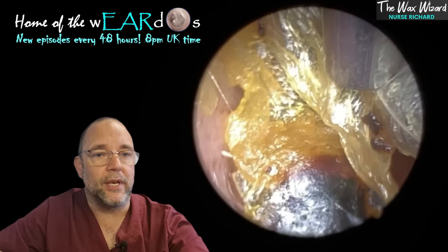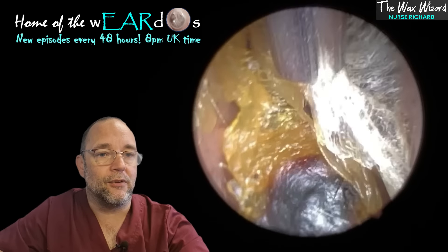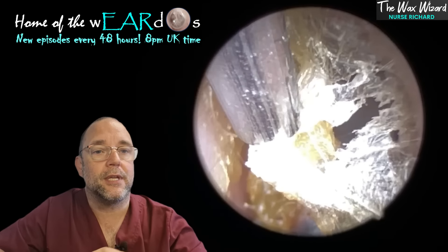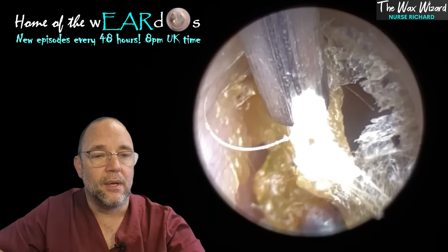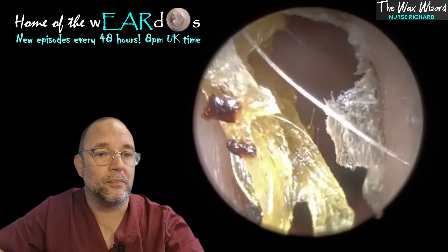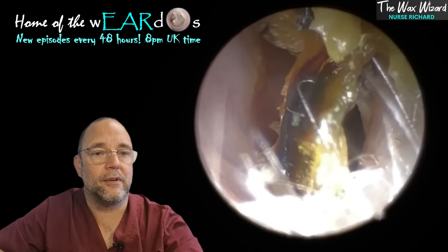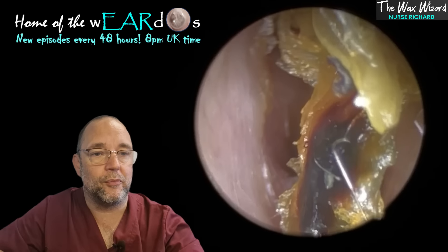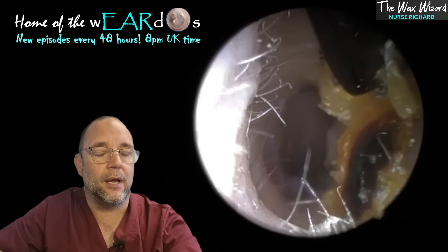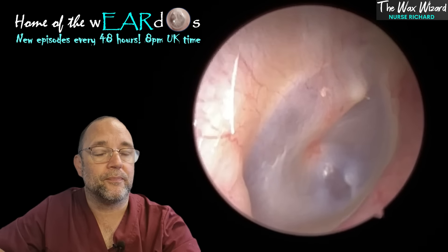The next one — this lady has quite a story. She had some bleeding in this ear, and I'm not sure if that might explain that little dark area there — it could just be very oxidized skin. She'd had surgery; I think it was a couple of years ago. She had a grommet put in. She actually believes it wasn't inserted properly, because it fell out quite quickly afterwards. A grommet is a little tube inserted through a cut hole in the eardrum to help equalize middle ear pressure. There's certainly no evidence of any grommets now, and this bit could be what migrated off the eardrum — it might have taken a couple of years to reach this point. It could well be a little bit of dry blood from the surgery.